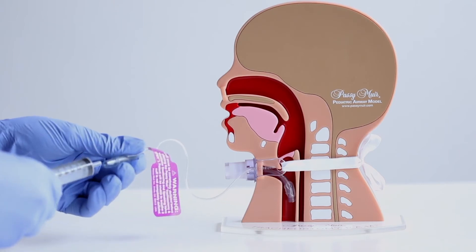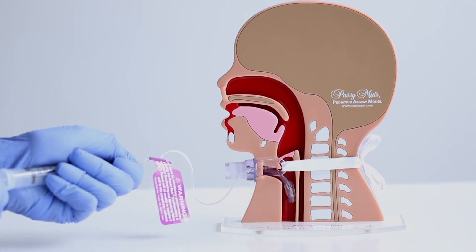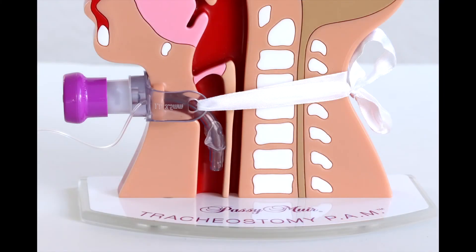Push the plunger of the syringe to remove air, and reattach the empty syringe to the pilot balloon needle valve. Pull back on the syringe until resistance is felt and no more air can be removed to assure the cuff is completely deflated. If the cuff is being deflated to assess the upper airway for the use of the no-leak Passy Muir valve, the cuff of the tracheostomy tube must be completely deflated.